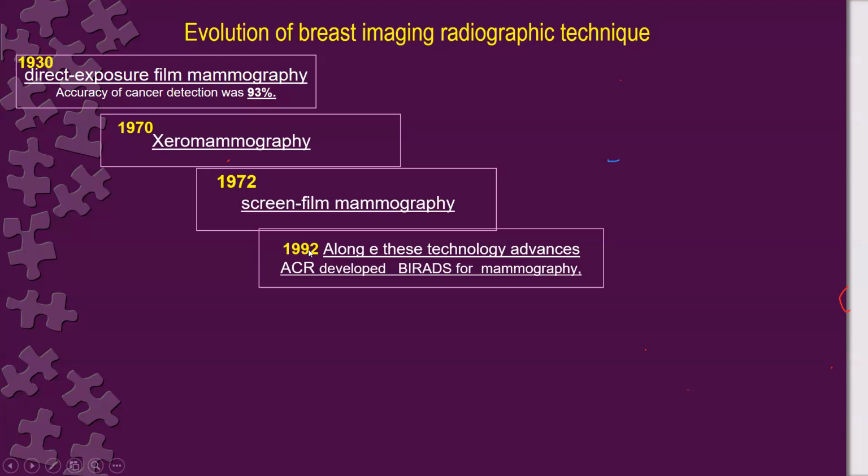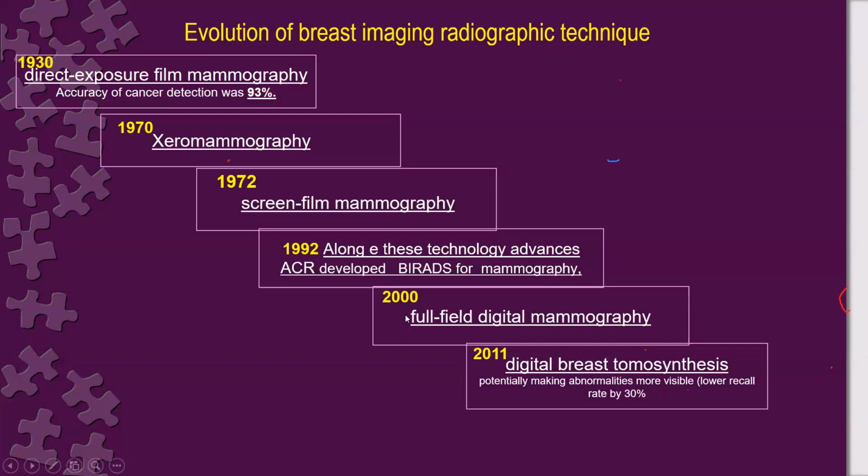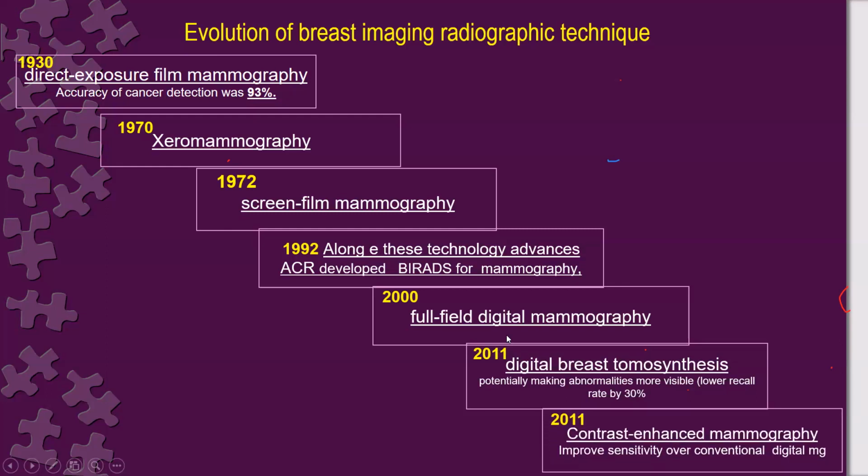And in 1992, along with these technology advances, ACR developed BI-RADS for mammography interpretation, and a big evolution appeared in 2000 with full digital mammography, used up to date. And in 2011, both breast tomosynthesis and contrast enhanced digital mammography era were seen.